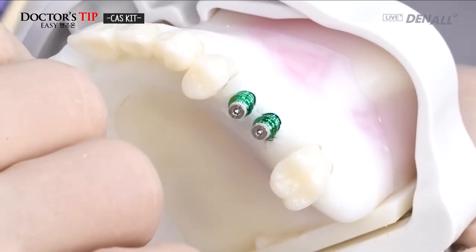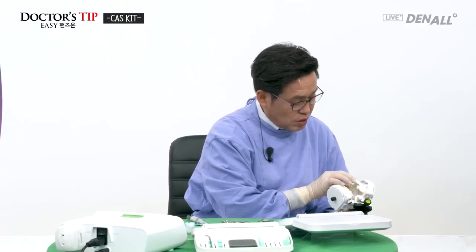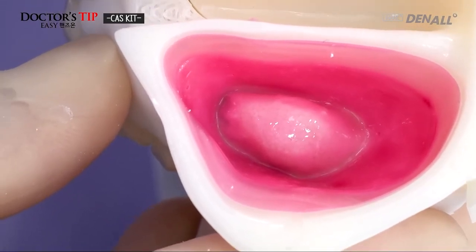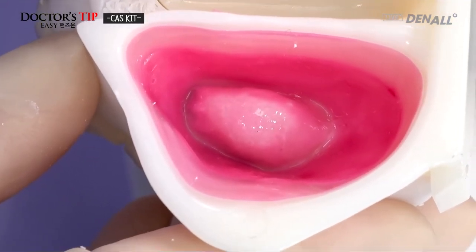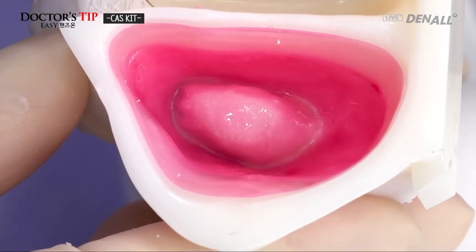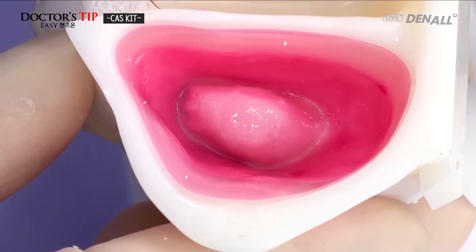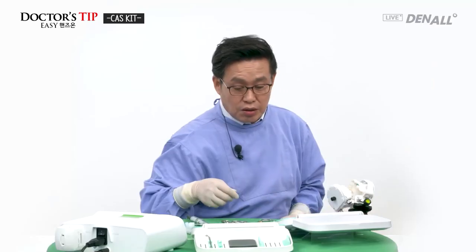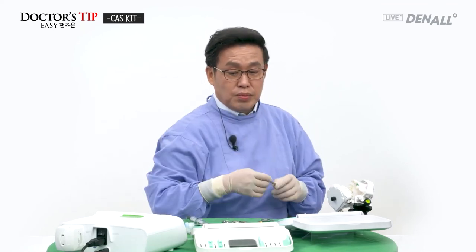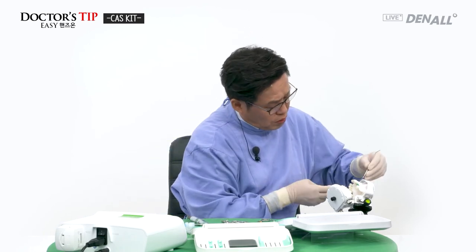Let's have a look at the inside of the sinus by removing this. This is the model. As you can see, bone materials entered into the sinus. The sinus membrane is lifted. As you can see in the sinus model, here the pre-mount is to be removed using the open wrench. The stability is good enough, so it doesn't matter, but I'm using the open wrench to hold it.